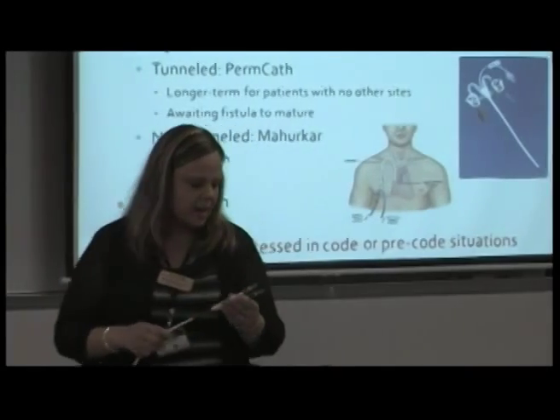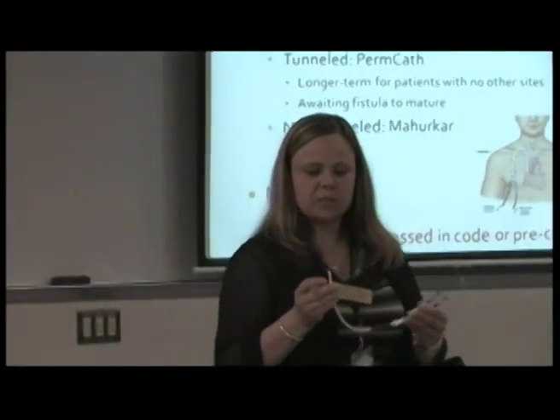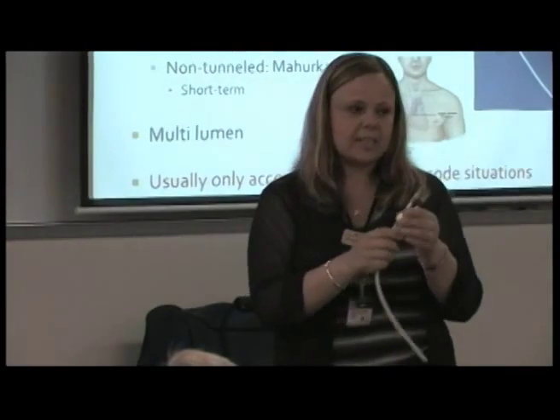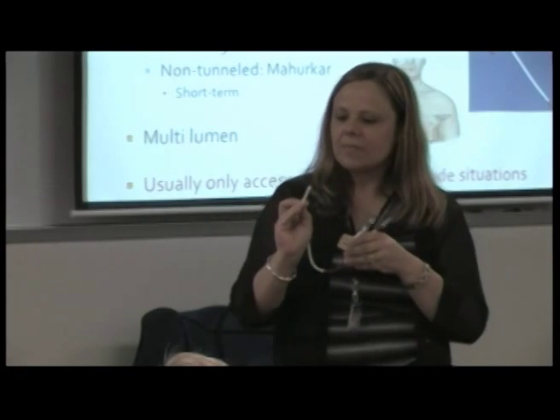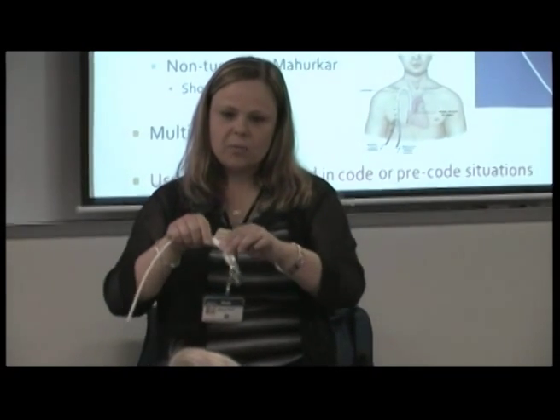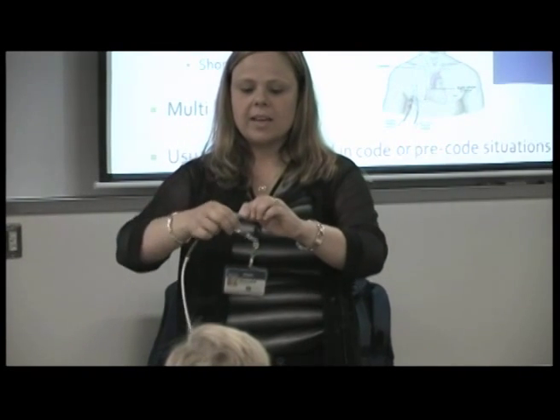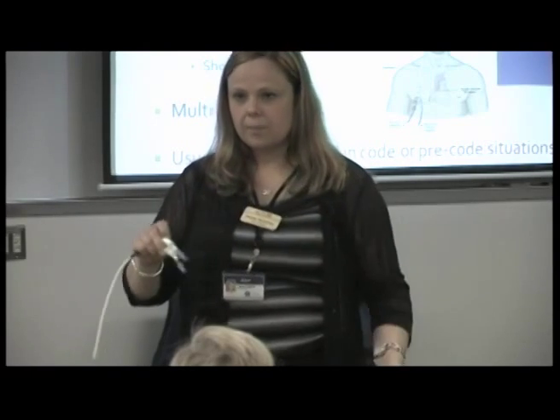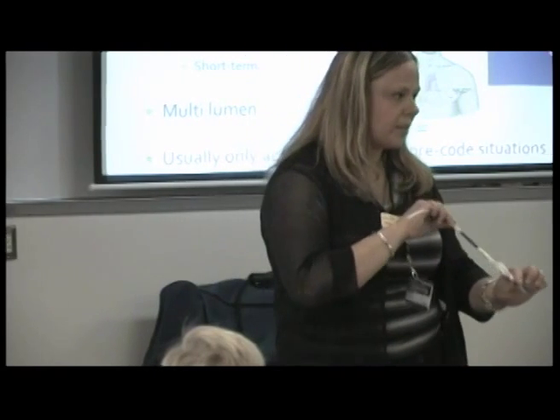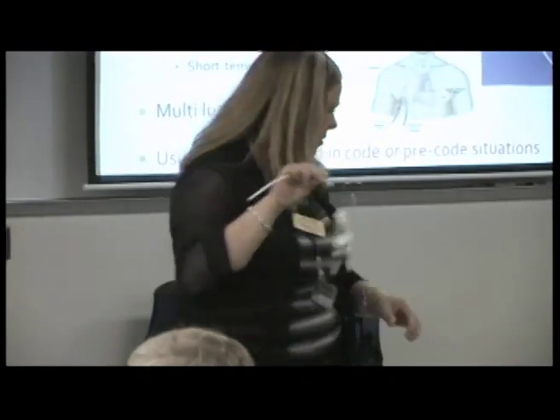I'm going to pass around one of these other catheters again because I just want you to see how huge this thing is compared to the other central lines, for the purpose of dialysis. But if one of these comes unclamped and we don't have one of our claves down here, and this cap comes off, or we take it off and forget to clamp it, chances are we're going to have a lot of blood coming out. So just be aware to make sure they're nice and secure.